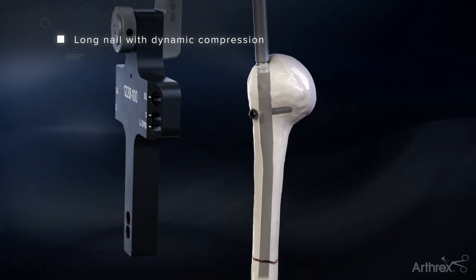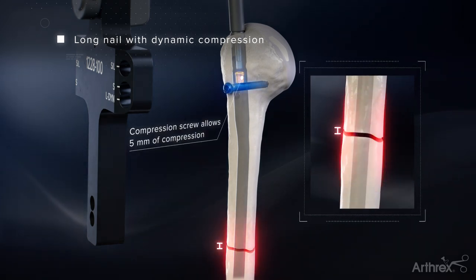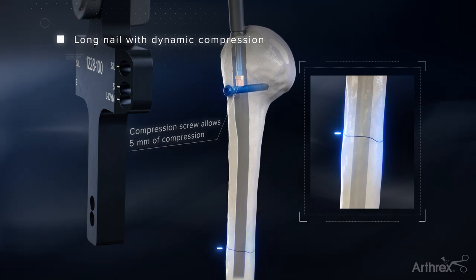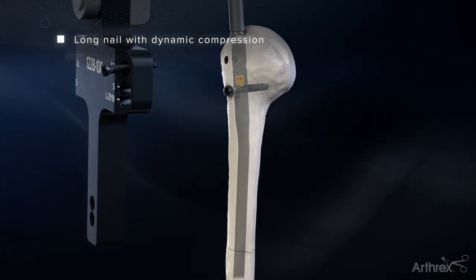Utilizing the same driver used to insert the compression nut, reinsert the driver down the top of the targeting jig and advance the compression nut until adequate compression is achieved across the fracture site. Repeat drilling steps for the remaining proximal screws where needed.